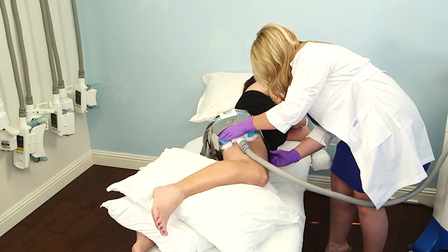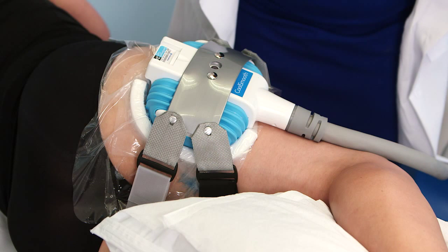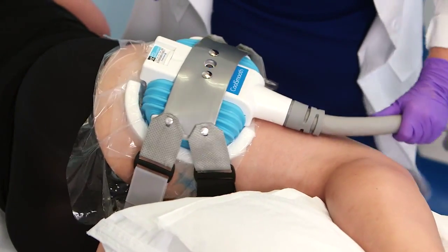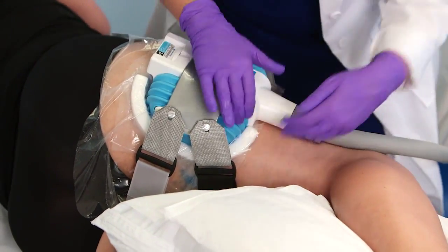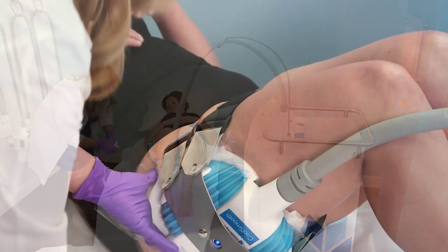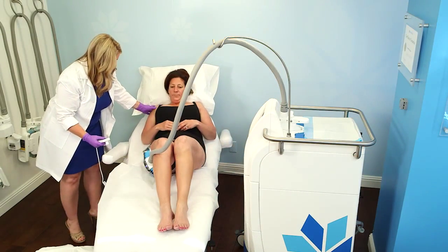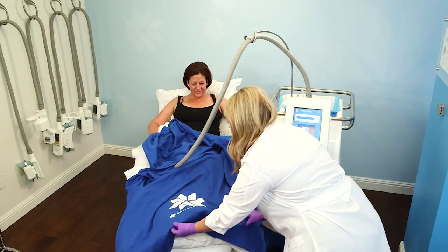Once all straps are in place, begin to tighten on all four sides. Visually confirm that the entire cooling panel is flush with the skin and no air gaps are visible. Apply pressure to the side panels to ensure there is no movement, and gently shake the applicator. If you observe or sense movement, continue to tighten the straps. After the CoolSmooth applicator is attached, secure the applicator in the support arm and help the patient onto their back in a comfortable position. Check the applicator to confirm it did not move during transition, and adjust the treatment bed to get the patient into a reclined position. Use pillows to improve the comfort of the patient and cover the patient with a blanket or sheet.